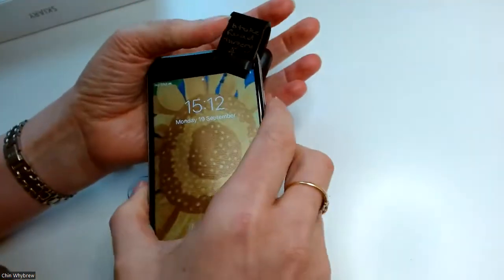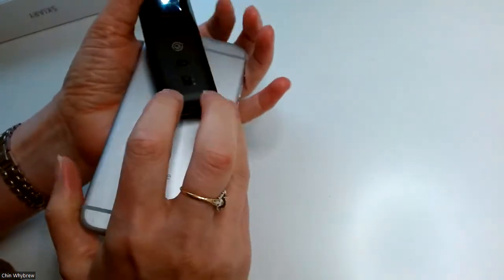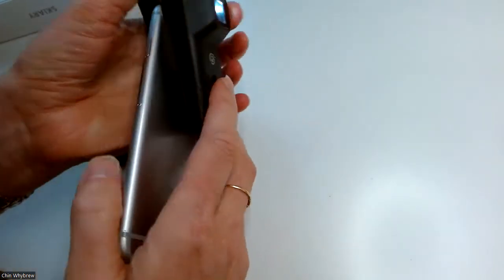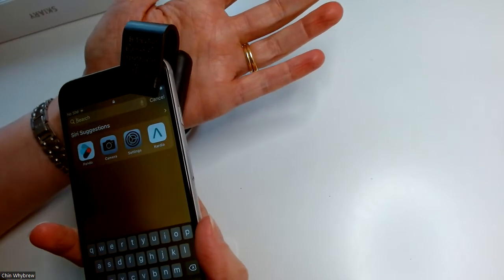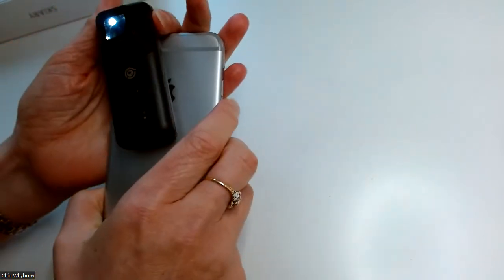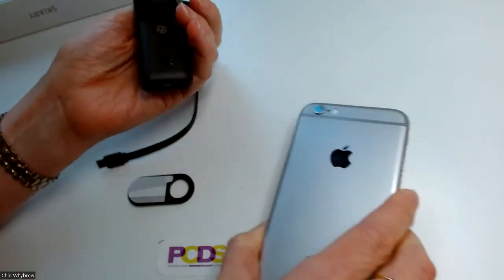Now the problem with this one is that in order to switch between modes, you're having to use this little tiny button here underneath it, and it's quite difficult, although not impossible, to switch between modes whilst it's still touching the patient's skin. So that's a slight downside of that one.